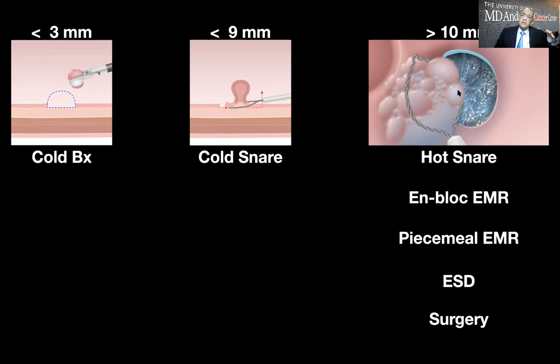For larger lesions, routinely, I think the best way to resect is endoscopic mucosal resection because you have fewer complications, because the submucosal saline prevents deeper thermal injury. If you suspect cancer, then it's better to go with ESD. And if it is obvious cancer, you should send the patient for surgery.